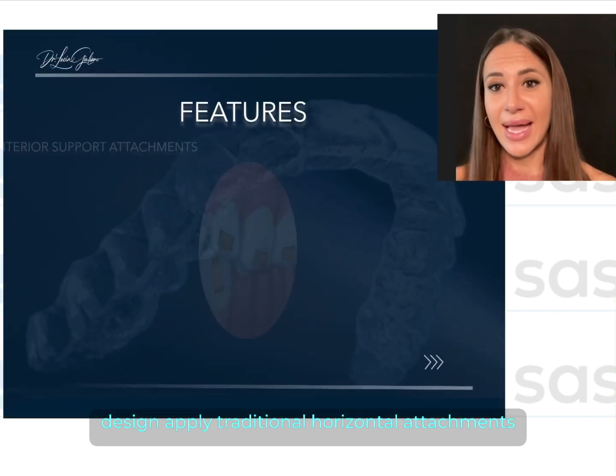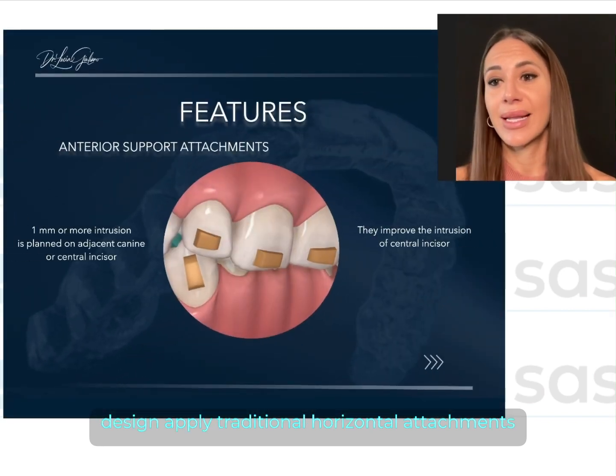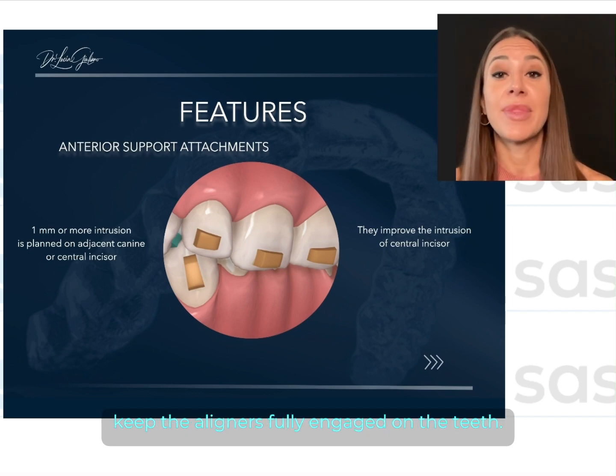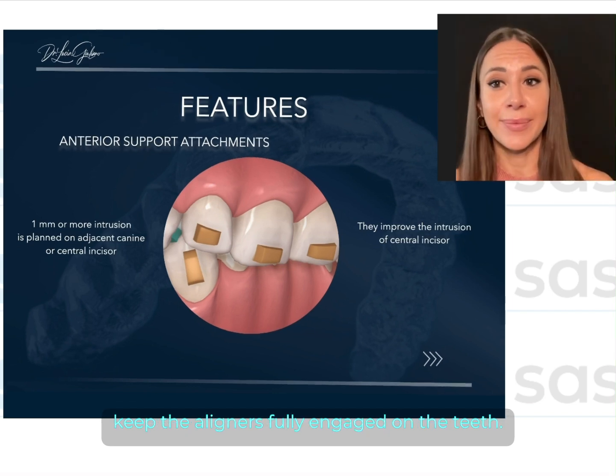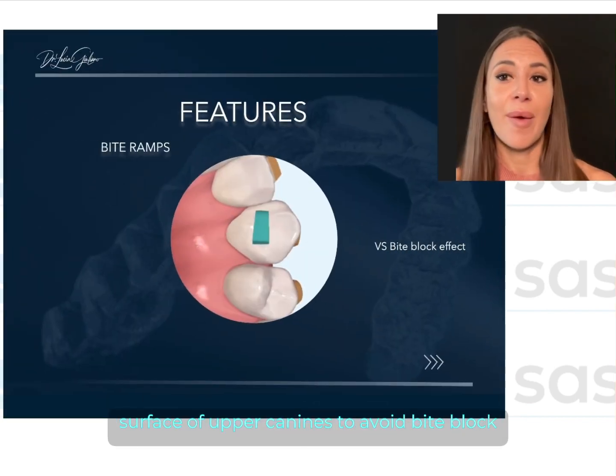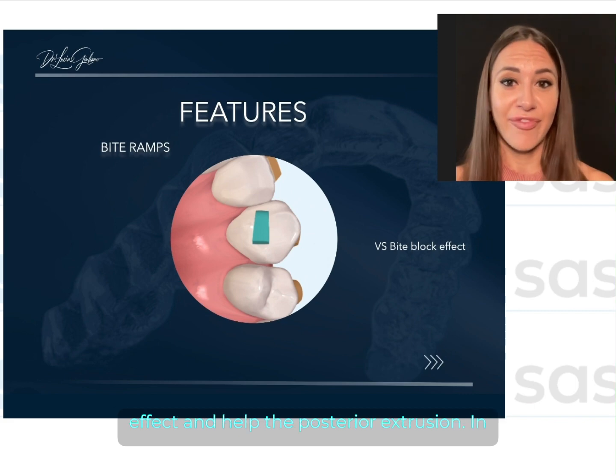About attachment design, apply traditional horizontal attachments instead of power ridges on upper centrals to keep the aligners fully engaged on the teeth. Please don't forget bite ramps on the palatal surface of upper canines to avoid bite block effect and help the posterior extrusion.